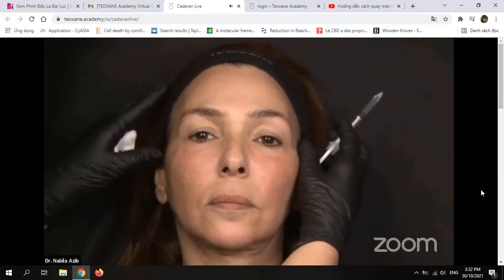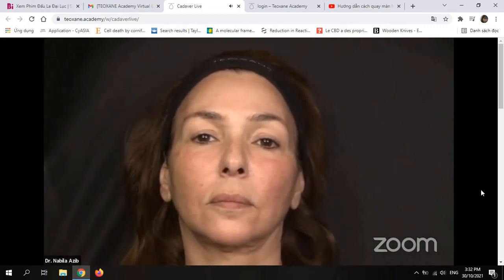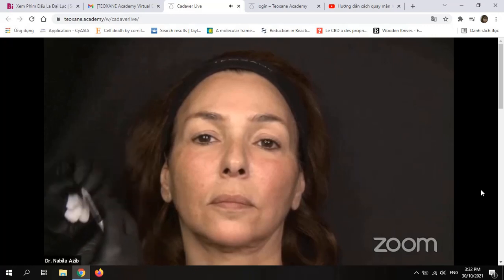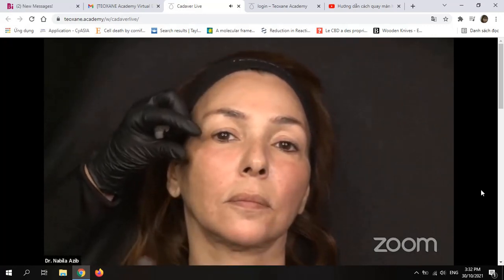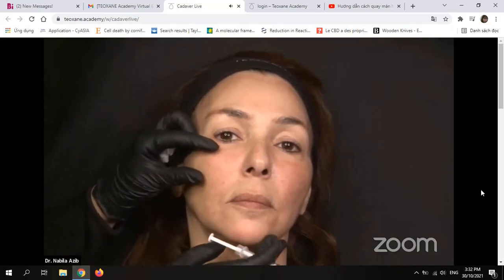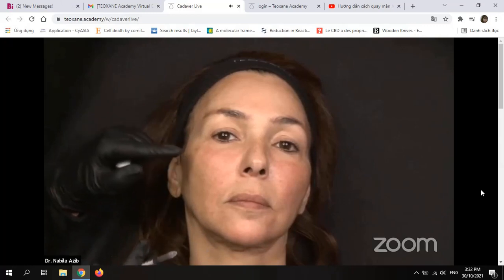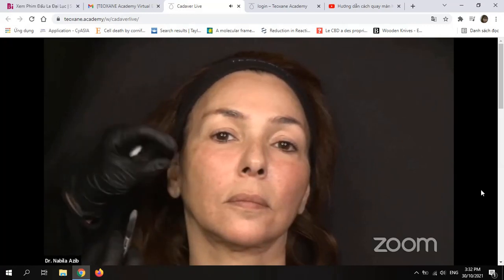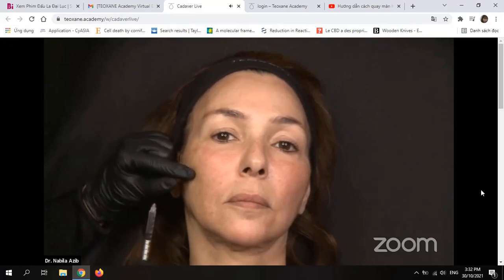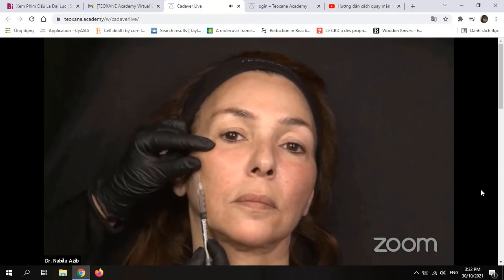Thank you, Ludmila. What a fantastic dissection, Patrick. It's amazing. Now I can have this projection in 3D on my patient. Each time I inject, I follow this anatomical danger. I try to imagine these dangers on my patient. So let's start. We said that we will start by the mid-face with the multi-layering technique, and my entry point is located under the zygomatic arch here, very superficially.